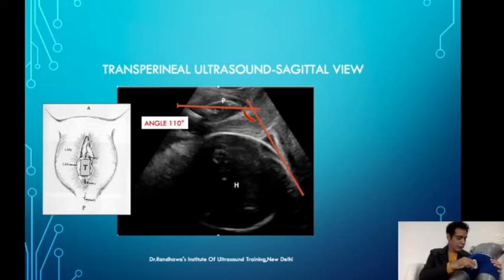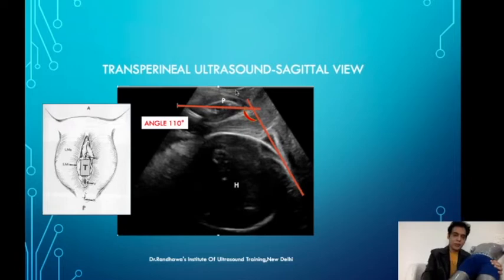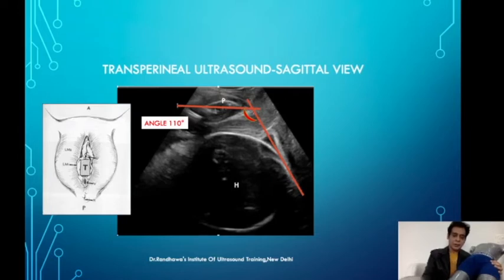We place the probe here and can feel the bony area of the pubic symphysis on top. If we move the probe up, the pubic symphysis will be in relationship to the inferior part of the probe, so it will appear in the lower area of the display instead of the upper area. This is useful to confirm the pubic symphysis in cases where a beginner has difficulty identifying it.